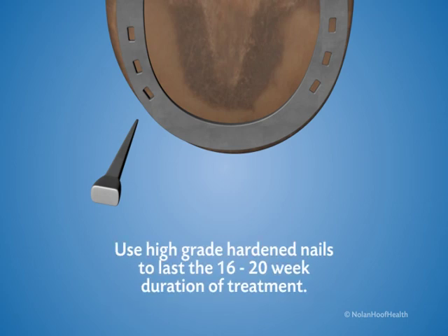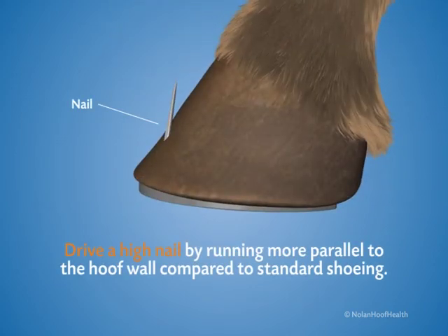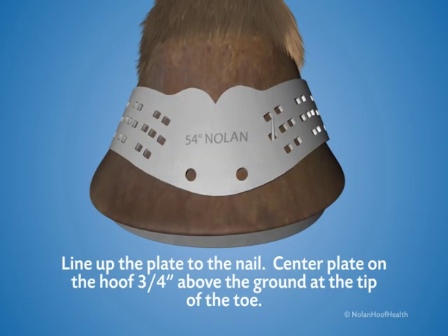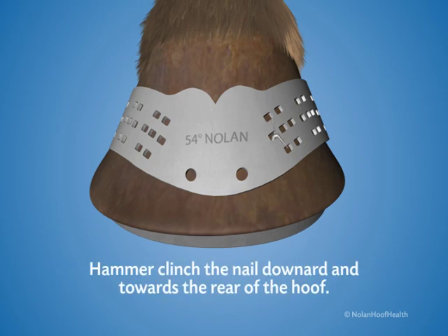Use high-grade, hardened nails to last the 16 to 20-week duration of treatment. Drive a nail through one of the front holes, driving a high nail by running more parallel to the hoof wall compared to standard shoeing. Line up the plate to the nail. Center the plate on the hoof three-quarter inch above the ground at the tip of the toe. Hammer clench the nail downward and towards the rear of the hoof.